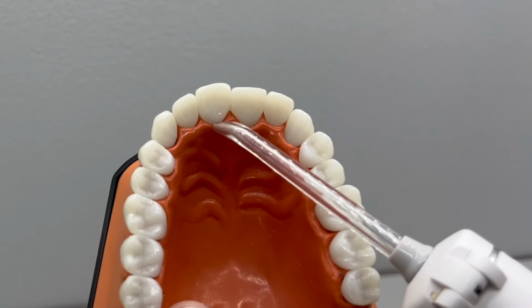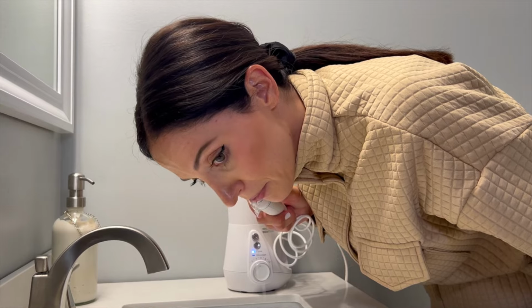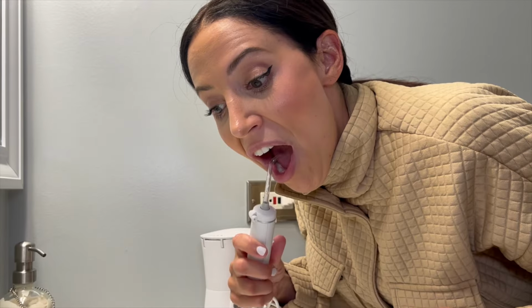This sometimes takes a little more technique, extra technique with making sure you keep your mouth closed enough, but practice really does make perfect. The more you do it, the more it will be easy to do without making a mess. Quick recap, lean over the sink, don't press on until your mouth is closed, and then guide the water along from tooth to tooth. You should always be moving it. Don't leave it in one spot for too long, but it's okay to take that brief pause. Pause, pause, like that, in between the teeth.